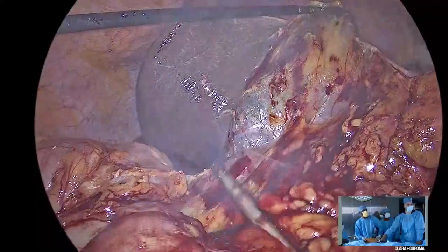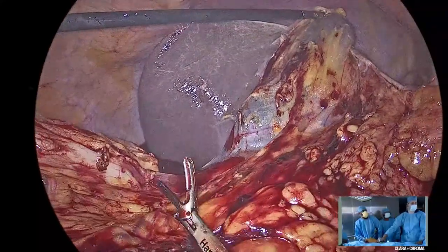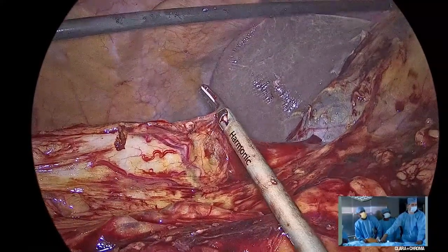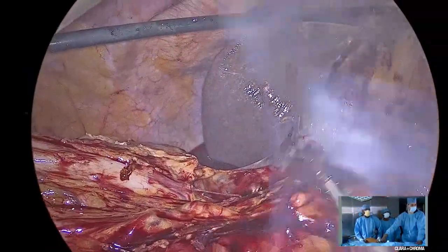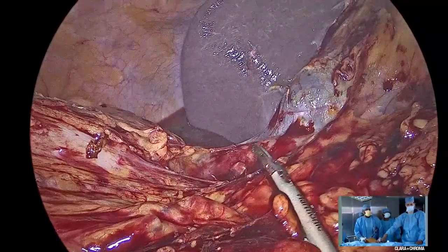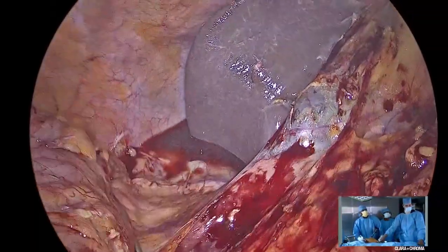Duodenum there again. Yeah. Very, very close. Normally, you don't see the duodenum at that level. I think the previous surgery has just pulled it up a bit. I think it must be a pyloroplasty, as Dr. Kriplani said. A common procedure, if you remember, when we were students and residents. Ten seconds ago, I was expecting the duodenum to be somewhere here, but it's got pulled up there because of all these adhesions.